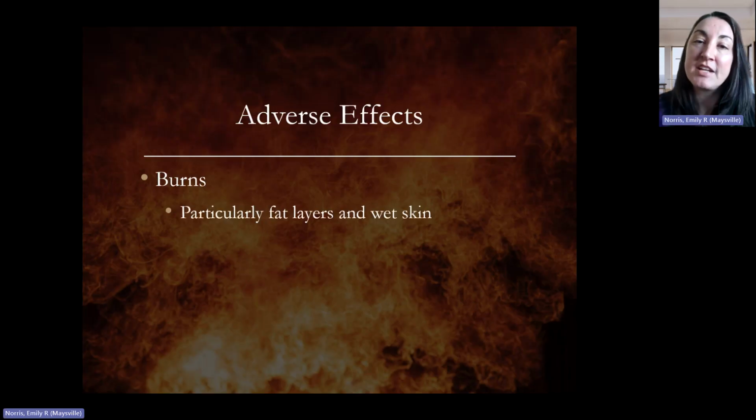The only adverse effect is a burn, and it's specifically over fat layers or wet skin. So you want to be careful that the skin that you place it over is dry and that it's not over some very fatty tissue.